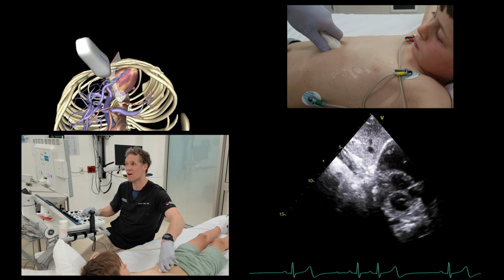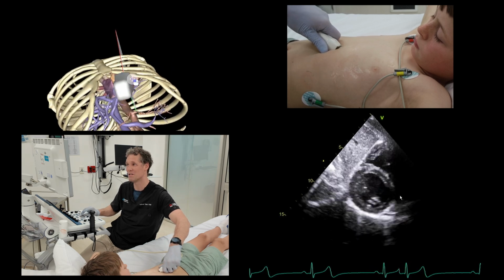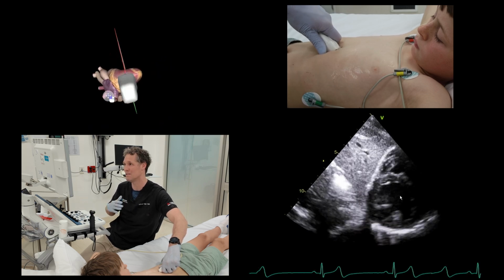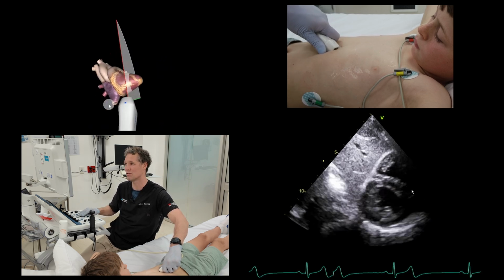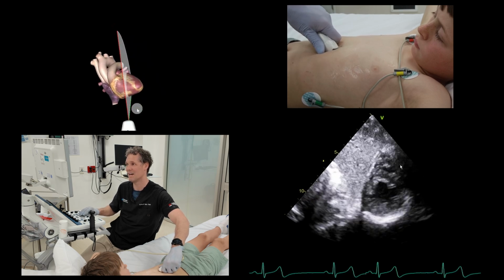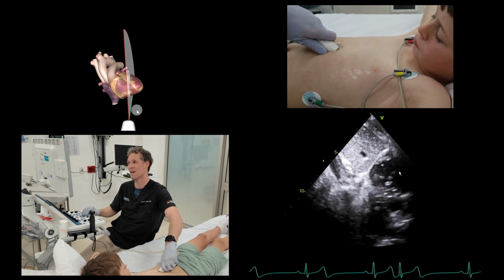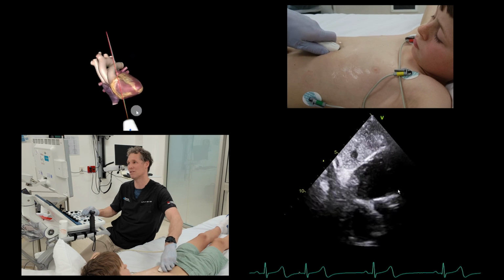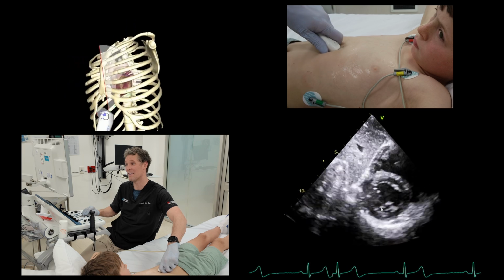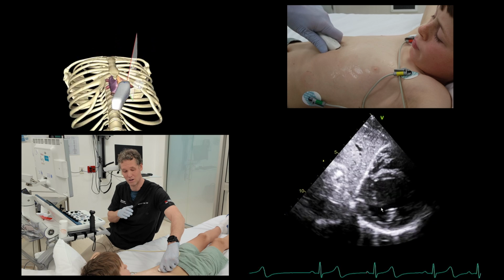But if you carry on going and fanning over to that patient's left, you can get the lovely, nice final view, which is really good for patients who are on things like mechanical ventilation, because sometimes it's a bit hard to get some of the views. And here you can get what's known as a subcostal short axis. Here's the left ventricle with the right ventricle around it. If I keep fanning one way, you go down to the apex, keep fanning the other way, the mitral valve all the way up to the aortic valve, which you can't quite see brilliantly there. But you get the idea, right? So that you can have another bite at the cherry of trying to have a look at the heart.